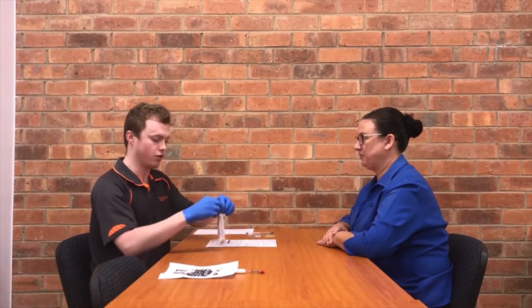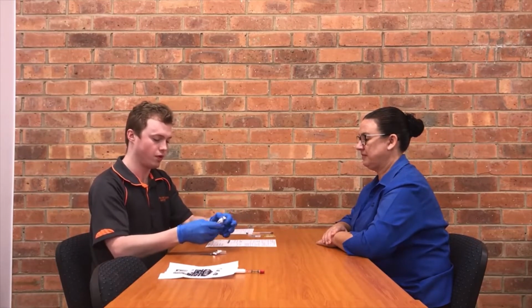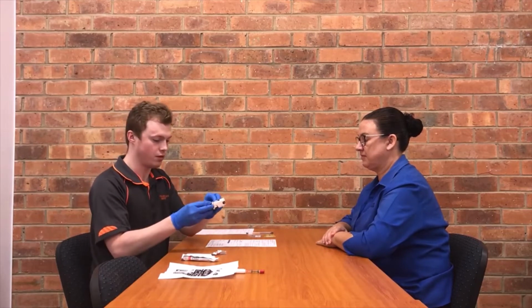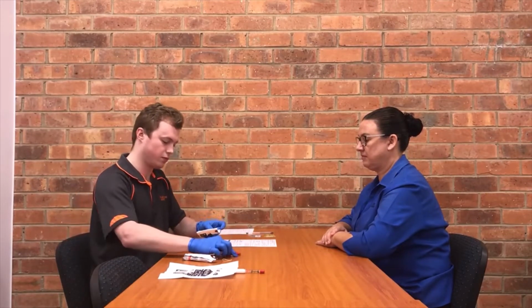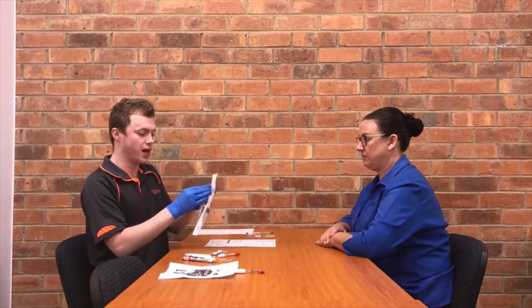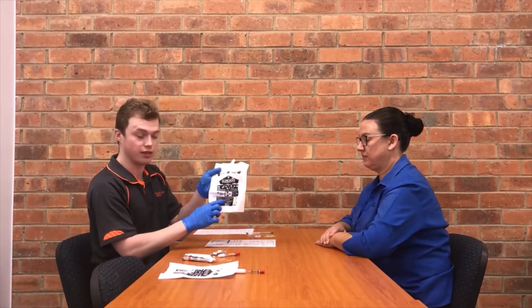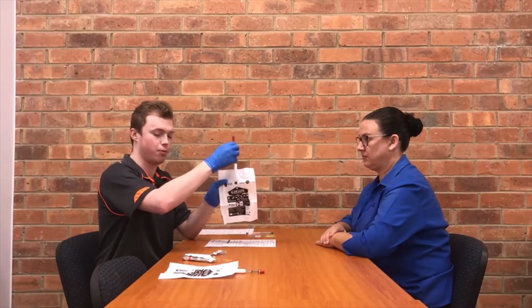So now we've got that ready. Now it's time to test the donor. So open up. It'll be bundled up like this, and separated into 2 parts. You've got the bag here, instructions on the bag as well, pretty easy to follow. And you've got the little insert piece here, which you'll insert in top when the time comes. Something I did forget to mention, obviously you have gloves on for this entire process.